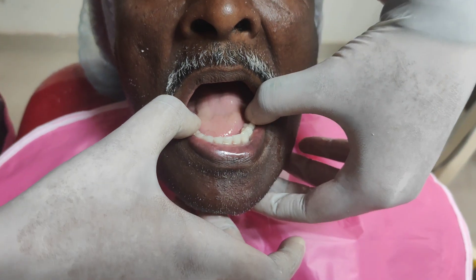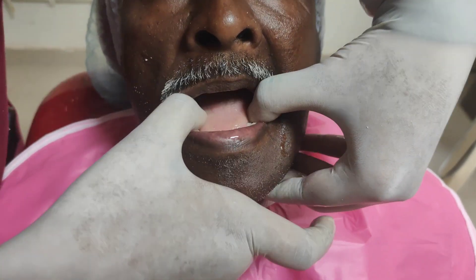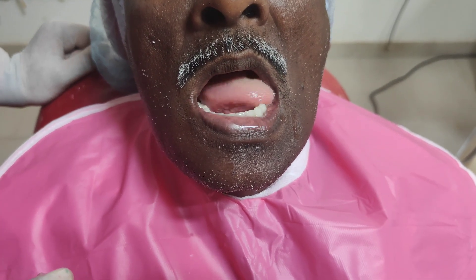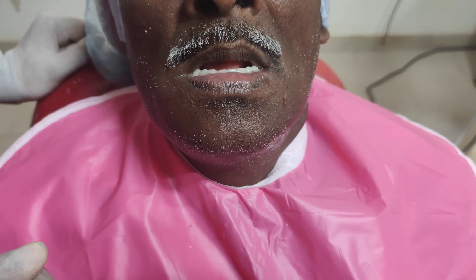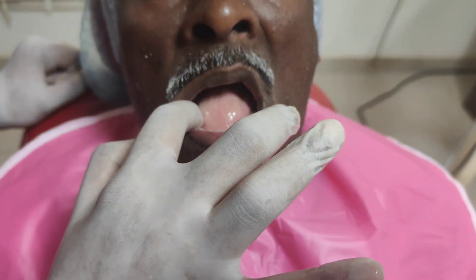After checking the stability of the maxillary denture, the stability of the mandibular denture is checked. The patient is asked to perform all functional movements of the tongue. Also, when the denture is pressed on the left side, it should not lift on the other side.